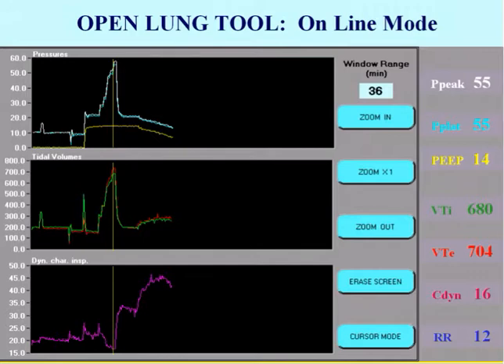Then, after reducing this recruitment pressure and maintaining the gradient low, you can see that there's a dramatic relief of over-distension. We have a first plateau in compliance here. And then we proceed with the closing pressure titration. Here's the stepwise decrease in PEEP levels, an increase in compliance to a maximum, and here we have identified our closing pressure at 9 centimeters of water.